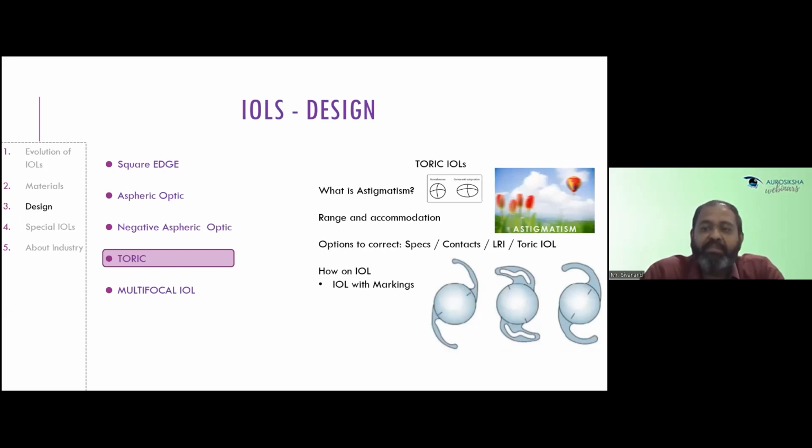There is a third dimension involved when we are making this particular lens, and hence the cost is more, okay? And I am sure you all know that for each power, you have to make a lens, so the inventory is more. So with toric, the inventory holding is much higher, and there is a learning curve involved, a little bit for the surgeon and a little bit for the biometry team and the refraction team of the hospital also, because you have to take the K reading, and the company people generally help out with the selection of the right IOL for the patient.